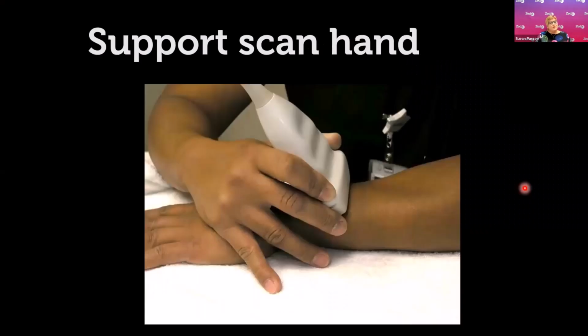The first tip that I give you is to make sure that you also are in a really comfortable position. I recommend that you sit down where possible and adjust the bed height so that your forearm and your elbow, if possible, are supported. What that does is it means that your probe is in your fingertips. You have maximum control over the probe, but it also helps you be really light with your touch and to sort of hover your probe over the affected area.